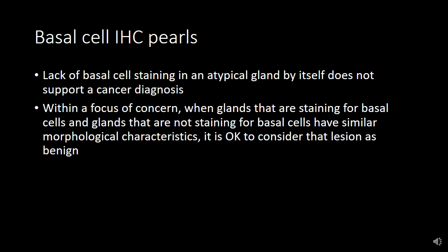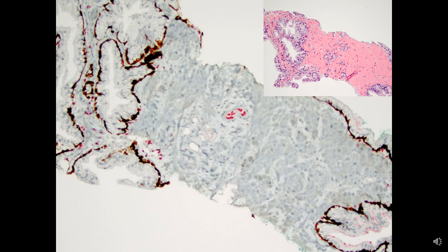Two key IHC pitfalls to remember: lack of basal cell staining in an atypical gland by itself does not mean you are dealing with a cancer diagnosis. You must carefully correlate with the morphological impression. Within a focus of concern, when glands that stain for basal cells and glands that do not stain have similar morphological characteristics, it is acceptable to consider that lesion benign even with that atypical staining pattern. It is also very important to have a strong internal control when interpreting basal cell immunohistochemistry. If your benign glands are lacking basal cell staining, you cannot make much of the absence of staining in your focus of concern.